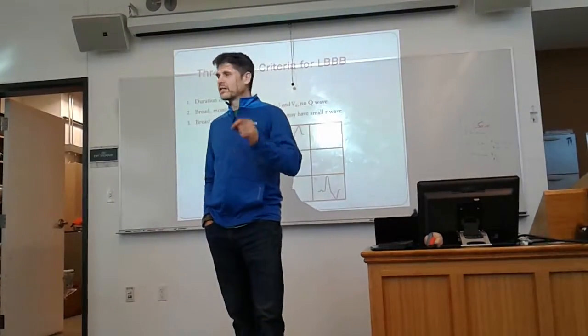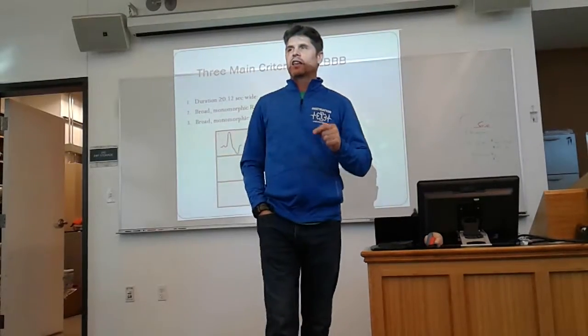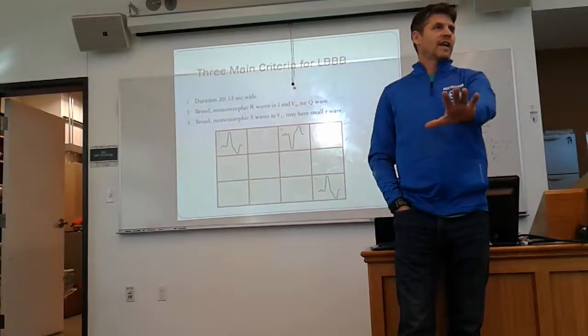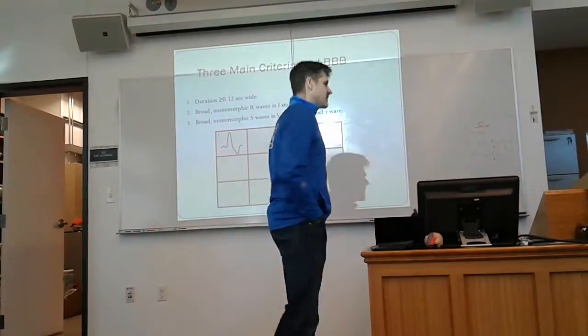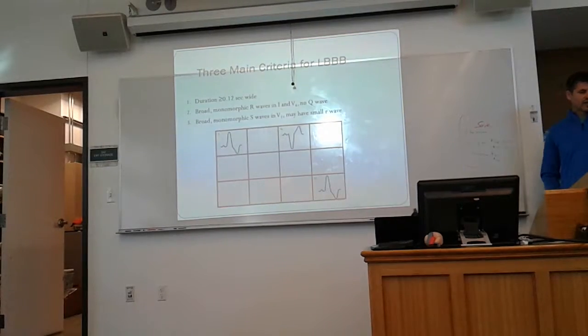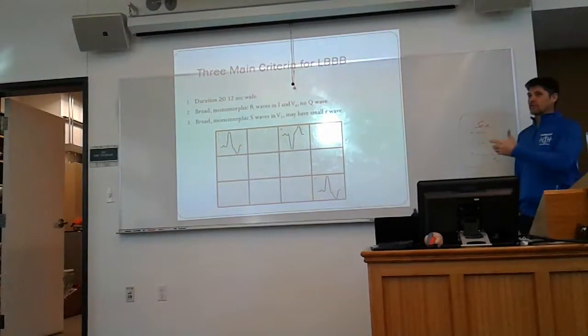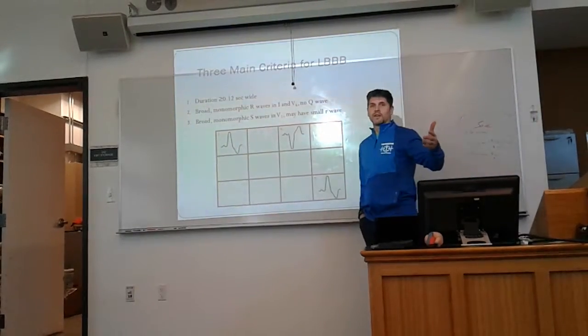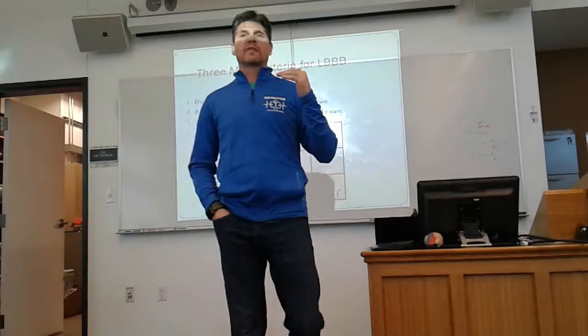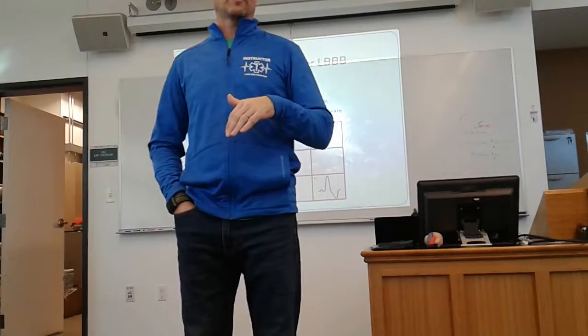But a left-sided bundle branch block can screw up your analysis from a distance. If you flash this 12 lead, number 8, in front of you, running across your monitor, depending on which lead you're looking in, you might think that this person is in a ventricular rhythm of some sort.